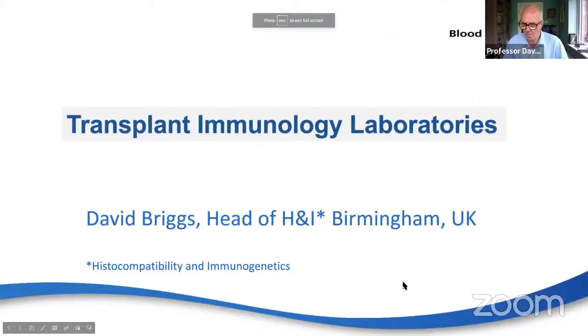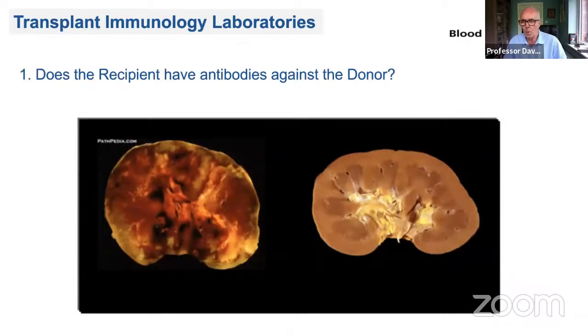Well, very kind of you to invite me to talk. I'm going to give a talk about why we need an HLA laboratory, a transplant laboratory, what we do, and when we do what we do. The why, I hope, is familiar to everybody. The main reason is preformed antibodies. If you've got preformed donor-specific antibodies against the donor, this is what happens: you get hyperacute rejection, the kidney clots, and is lost within minutes.